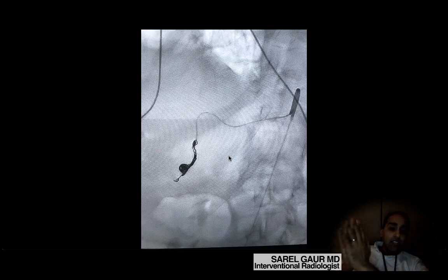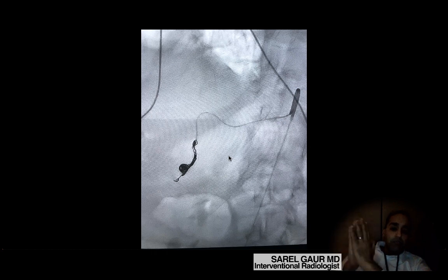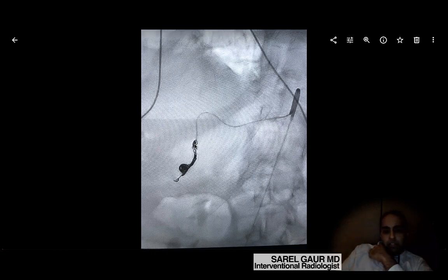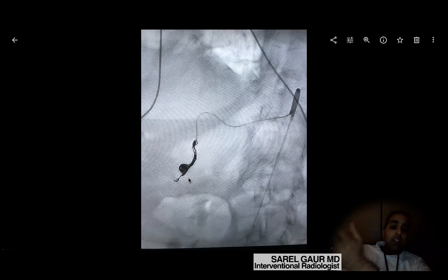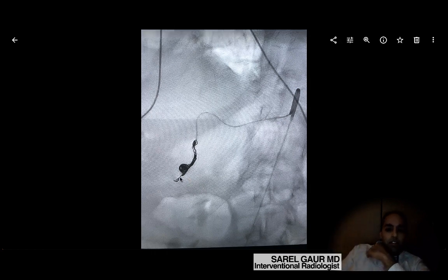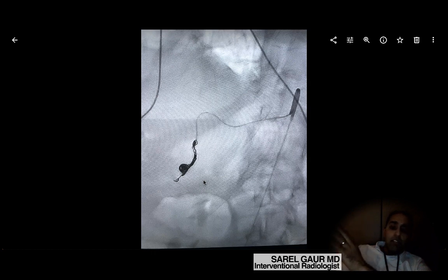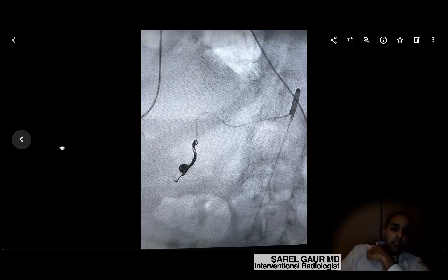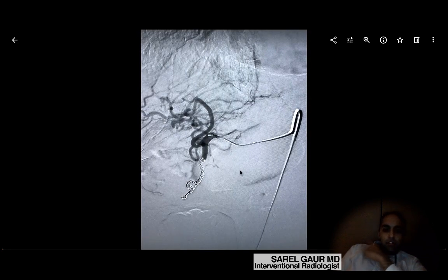I've excluded it from the circulation, and that's what you want to do with a pseudoaneurysm — basically take it out of the equation so that arterial blood flow does not see the lesion. The microcoils are literally like wires. We advance them through the microcatheter just like a wire, but then we can deploy the wire and it coils up into the space. Then we can use another device to actually detach those microcoils and leave them there. We do this work, get this result, and then do a repeat angiogram.